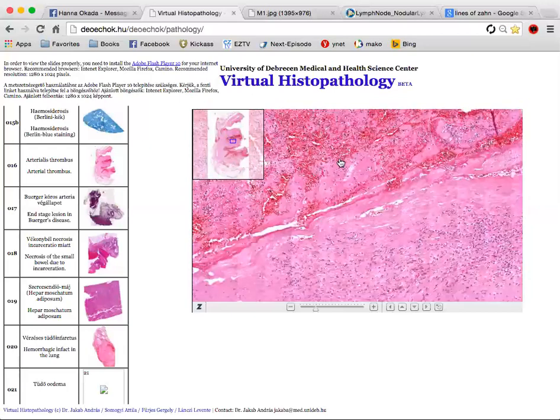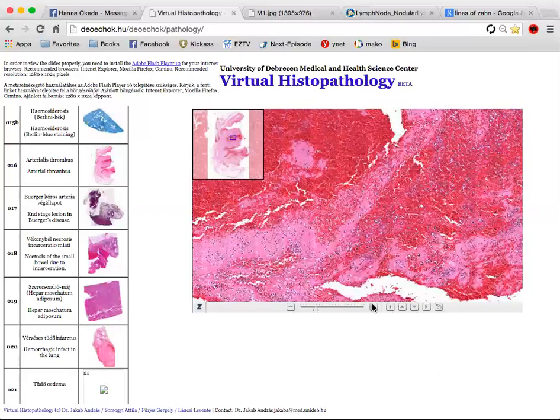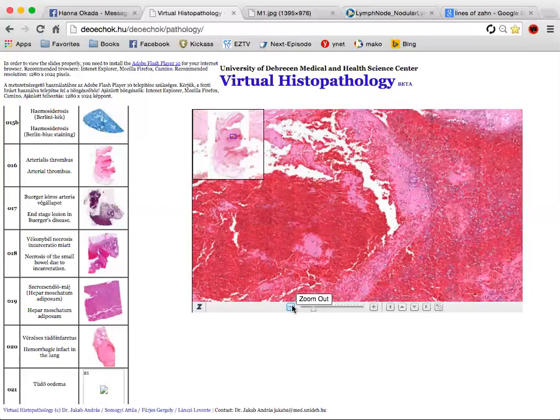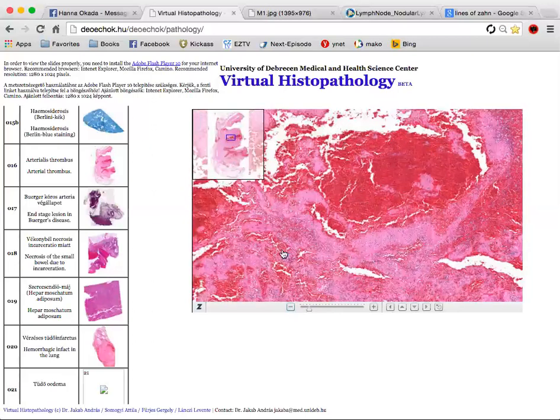They might just mention it because they mentioned it in class, I mean some of the teachers did. We cannot see the lines of Zahn here, right? No, it's just laminated because the flow wasn't fast enough to create them. Okay. Got it. Thank you. All right.